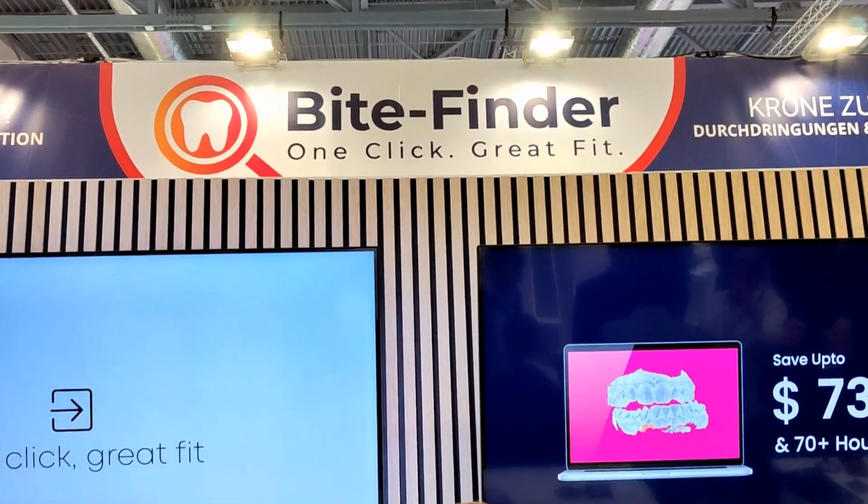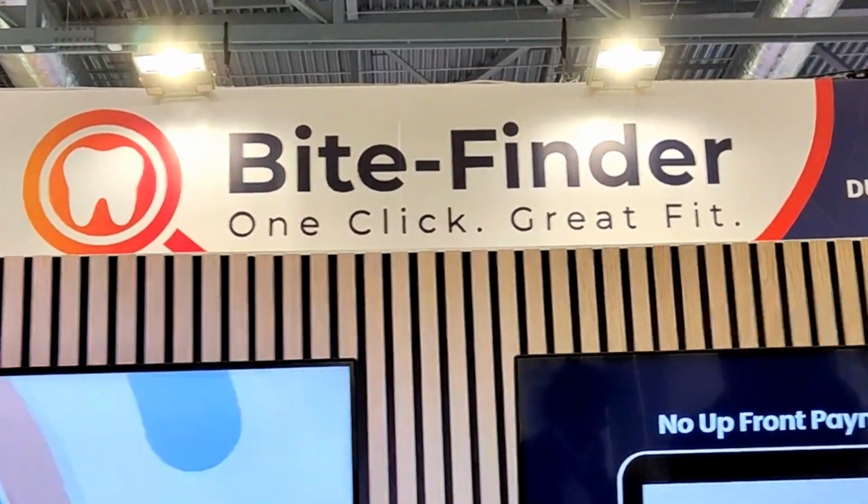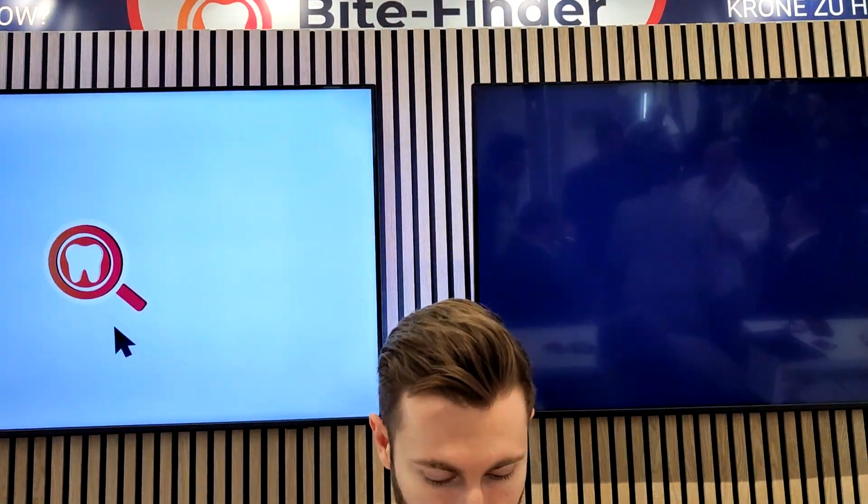And here is a very fresh, very new thing. I have heard about it only a few days before IDS. It's a Bitefinder project. And this is the brainstormer behind the project. Please, sir, introduce yourself. Hey, I'm Björn, nice to meet you.